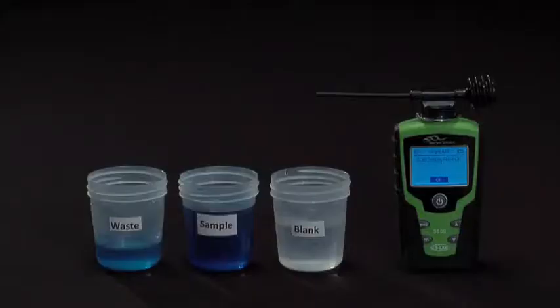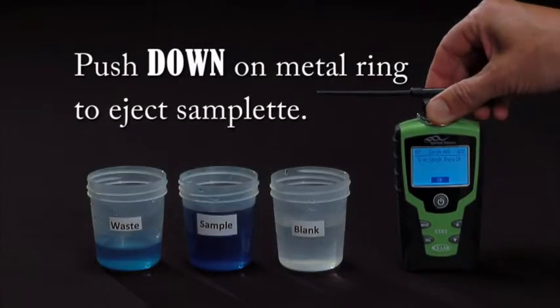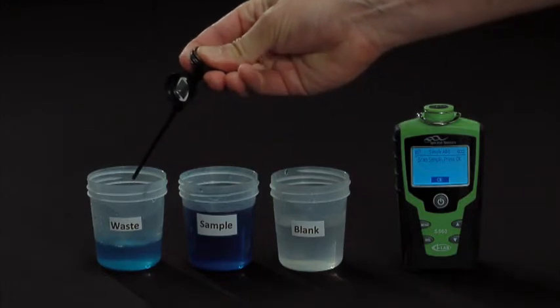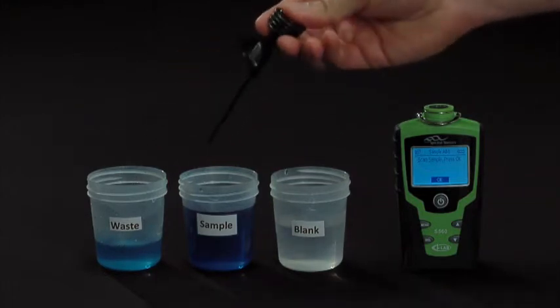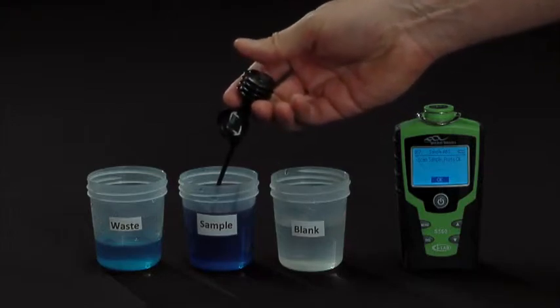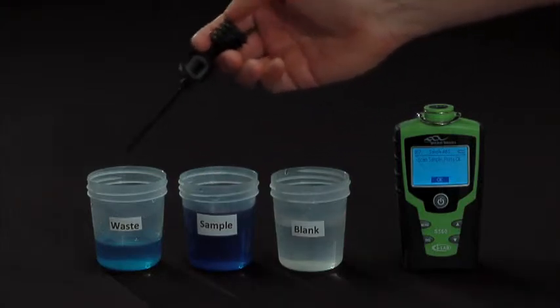Once the blank has been scanned, we'll eject the Samplet from the top of the iLab and expel the blank into a waste pail. We'll then draw the sample into the Samplet and expel that into the waste pail to properly flush the Samplet.